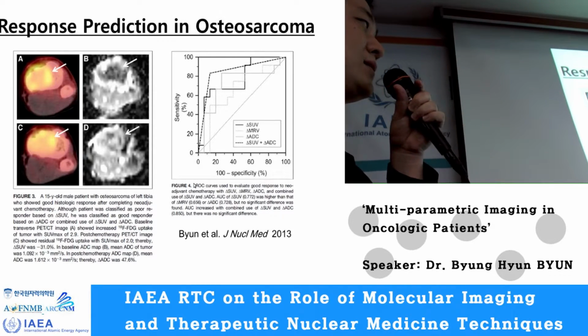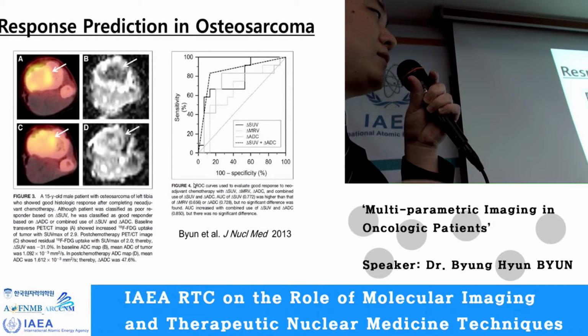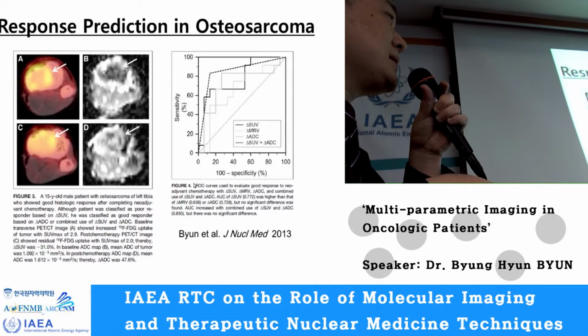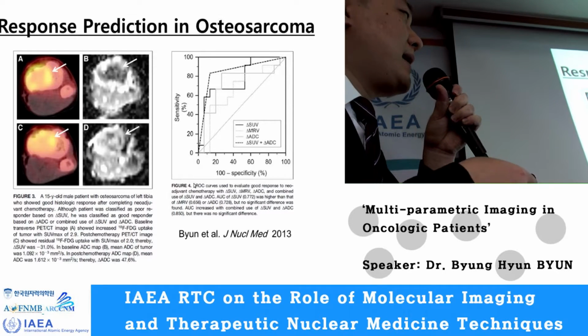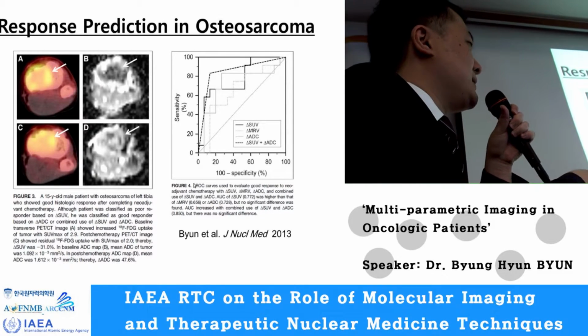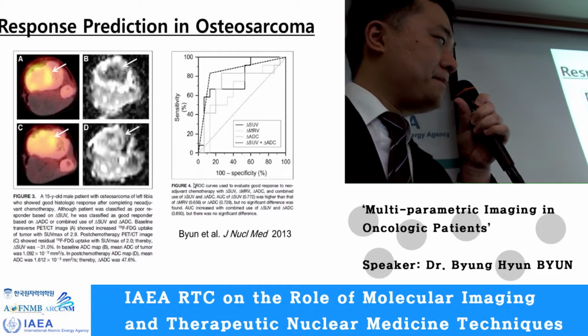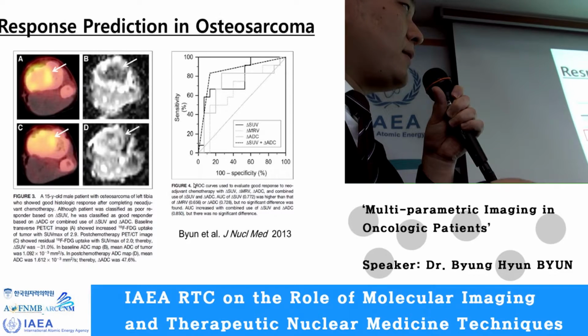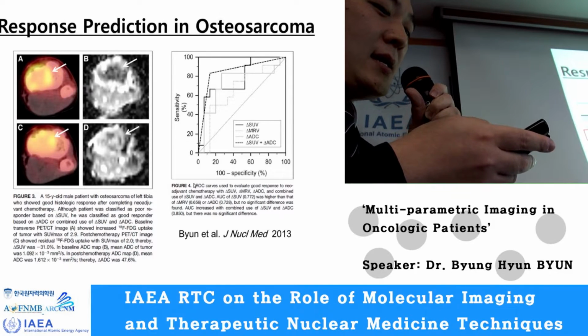By using these two parameters, we could predict the histologic response better than the SUV or ADC alone. The diagnostic accuracy was about 85%.